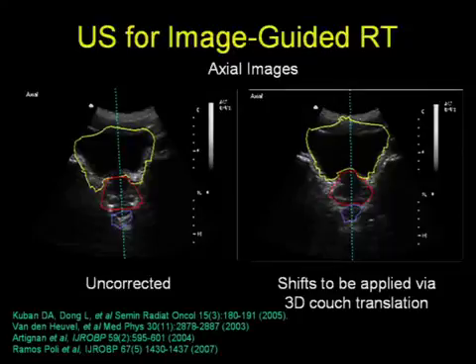And this is an example of how this device would be used clinically, where contours extracted from the radiation therapy treatment plan are superposed on top of the daily ultrasound image and provide information to the user that this patient on this particular instance is slightly misaligned, and provide an opportunity to correct the patient position and bring them back into the intended alignment. And there are a number of papers that describe these techniques and are provided here for your reference.